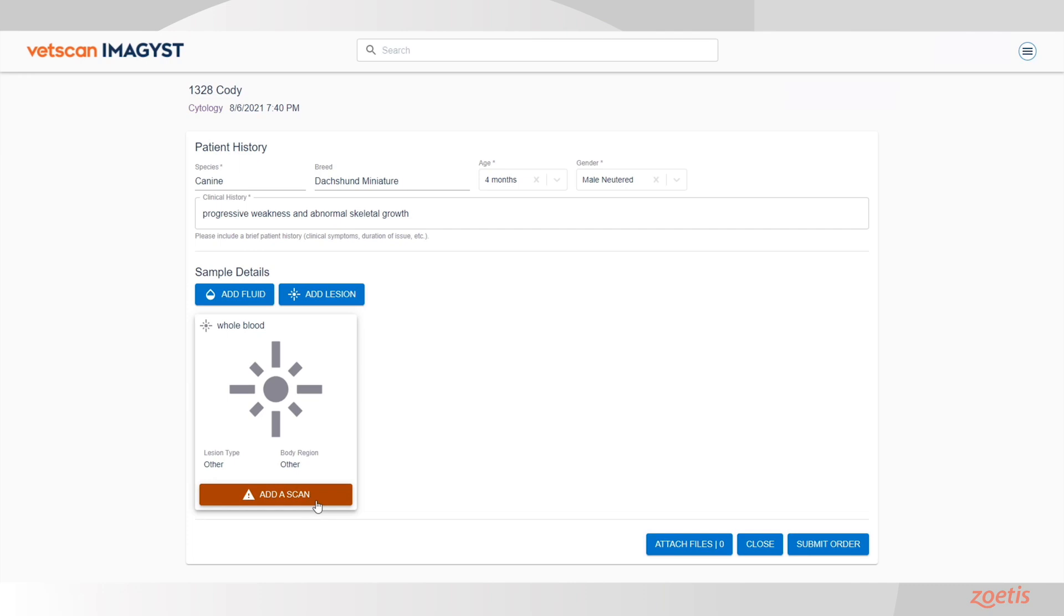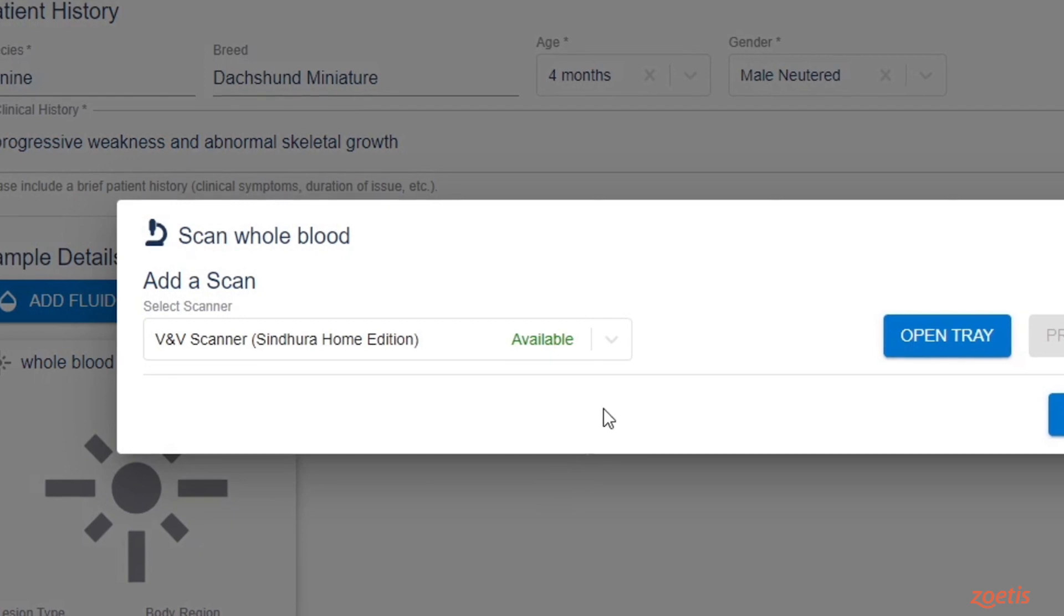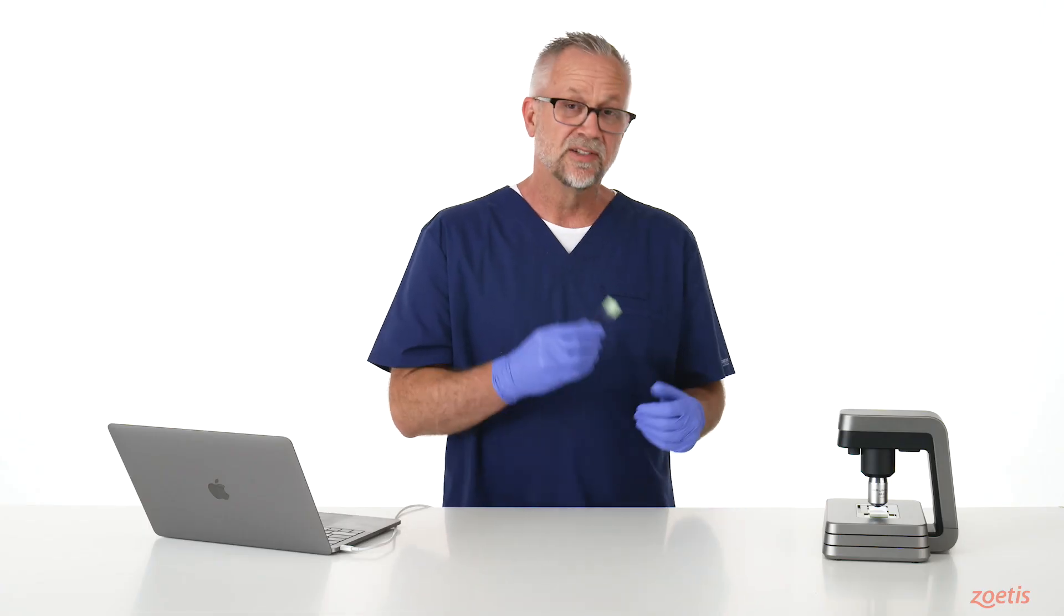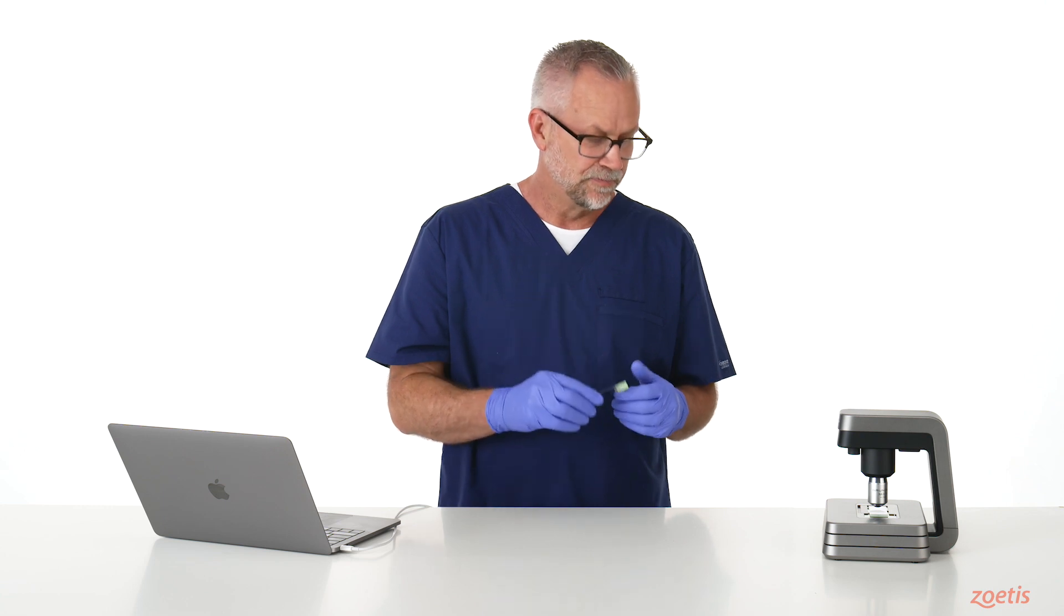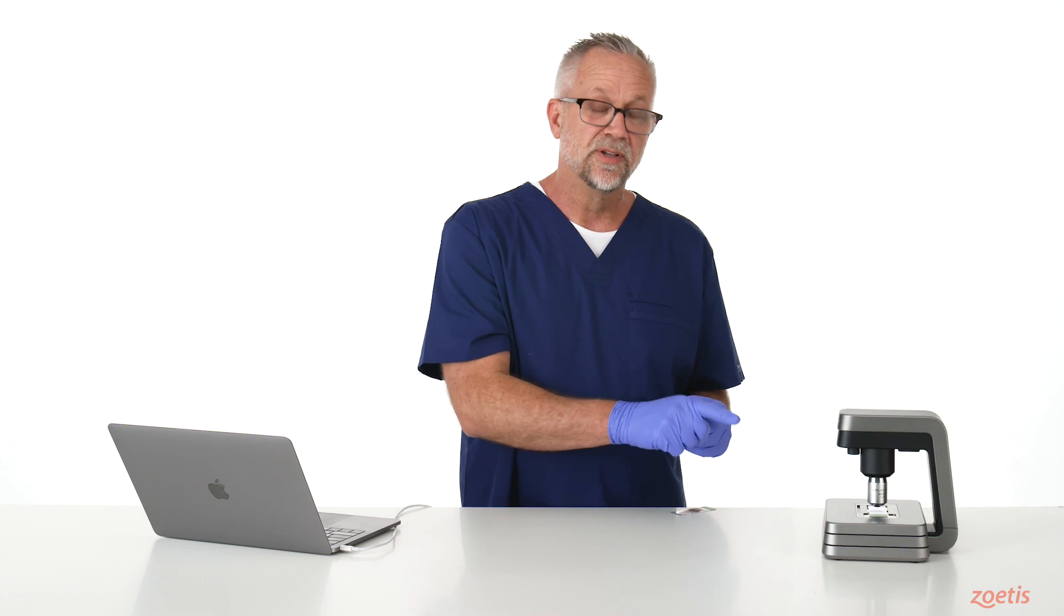Next, click Add a Scan. When the scan window opens, select a scanner. The next step is to place a slide on the scanner stage. Now, before you can place a slide, the stage needs to be in an open position.